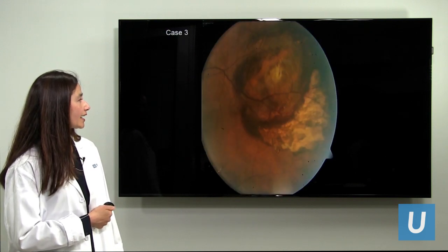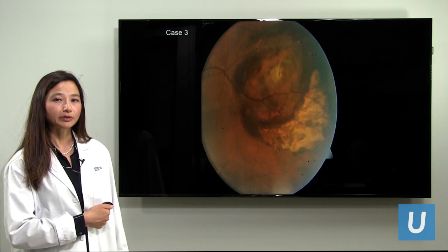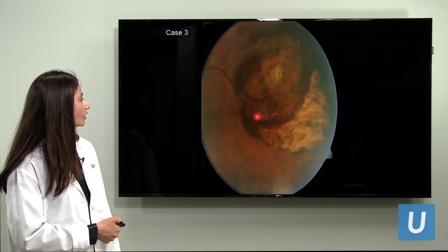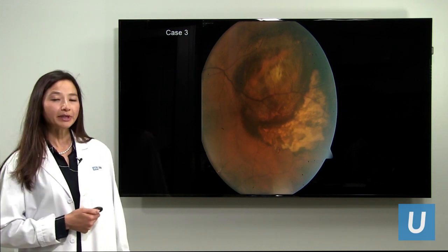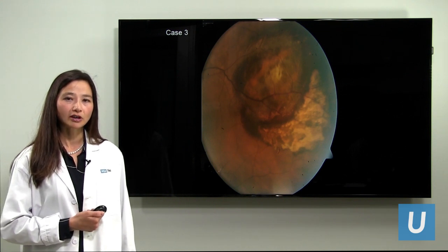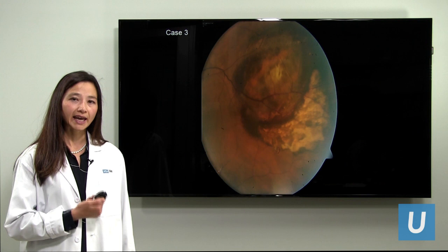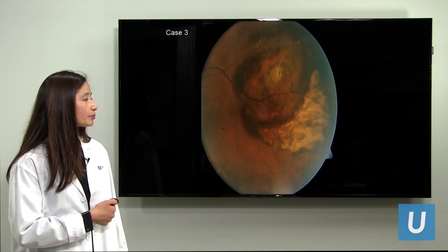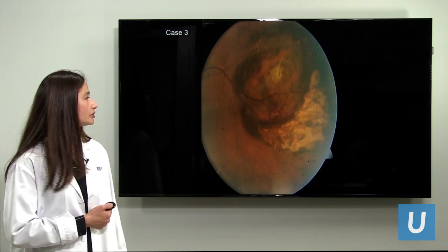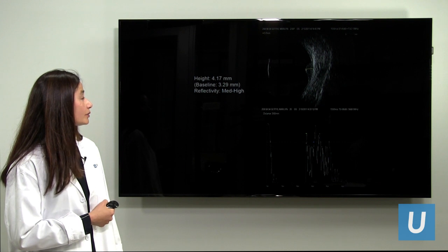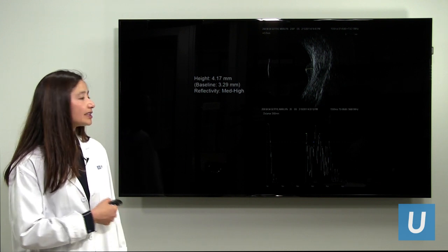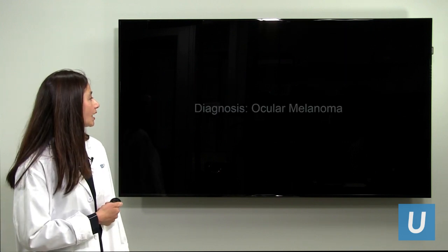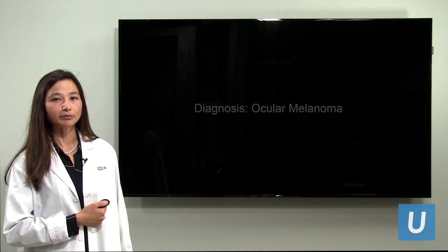This patient had a lot of blood at the macula — red and yellowish color — with an unusual looking lump in the middle. A common disease in older people is age-related macular degeneration, which can cause bleeding in the macula. However, this spot did not clear away, so the patient was referred. Ultrasound showed a fairly elevated lesion with reflectivity patterns consistent with melanoma. This lesion also grew with time, and the diagnosis is ocular melanoma.